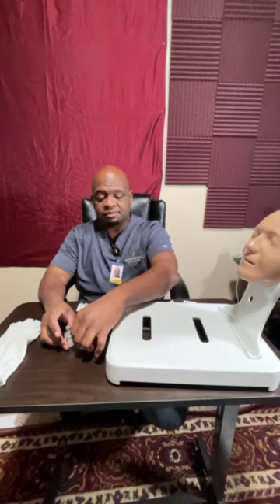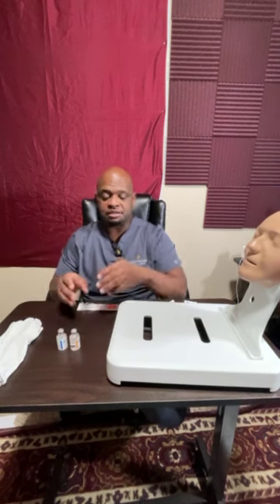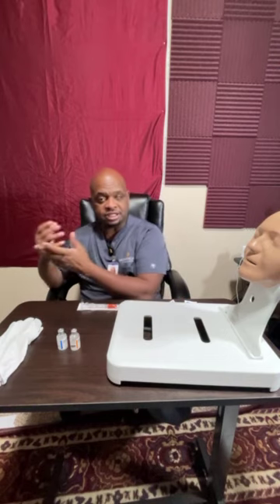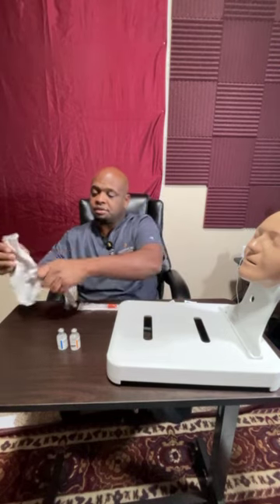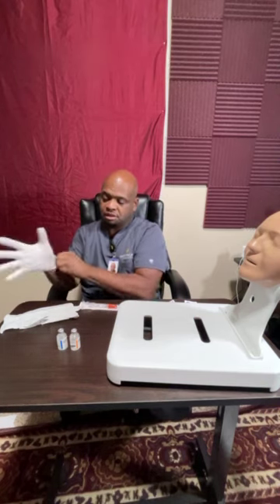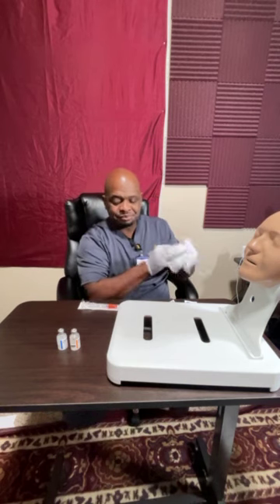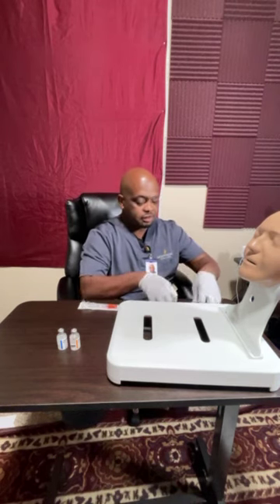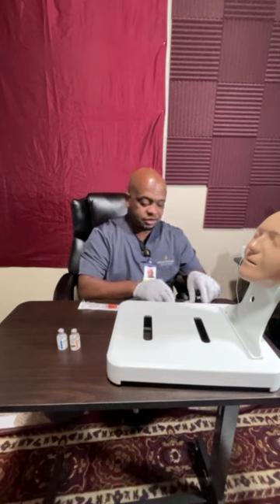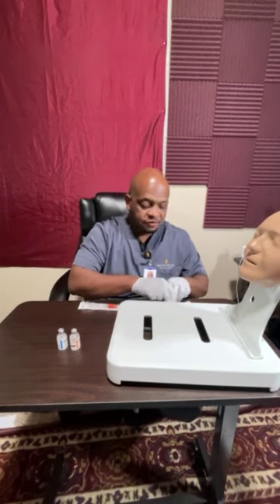She's also checking with me as we're checking the 6 rights again. We're both verifying the 6 rights, the right medication, the right dose. I'm going to do hand hygiene again. This time I'm going to put on my gloves. And I did bring in 2 alcohol wipes. Right, I got my gloves on, or almost on.